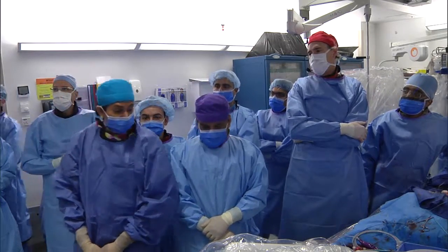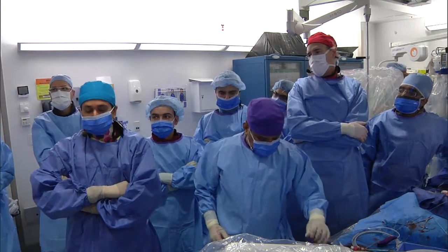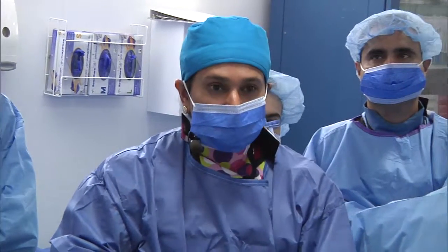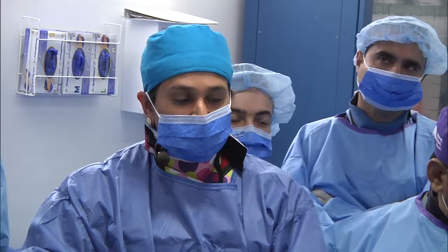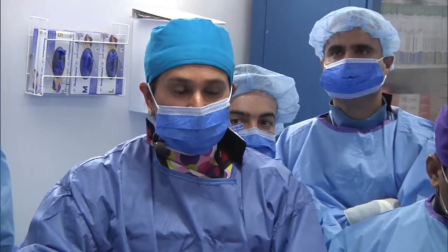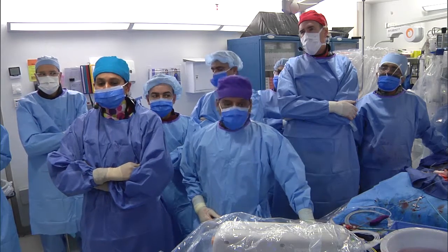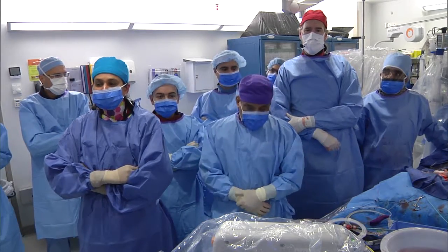Nothing. I think I could say that with left main occlusion, how catastrophic it could be, you should be at least prepared if it actually happens. The case shown is that having a stent anywhere in the LAD or left main is probably a great way to predict and prevent any kind of left main occlusion, if at all there is a case that you can predict. Yep. Okay, for Pedro, from our side, we are done.